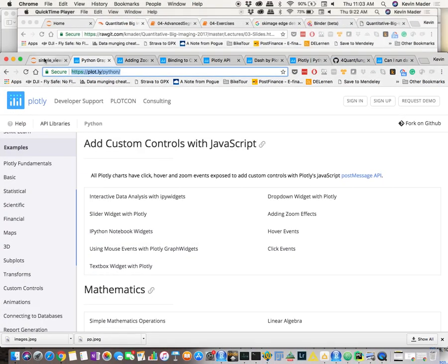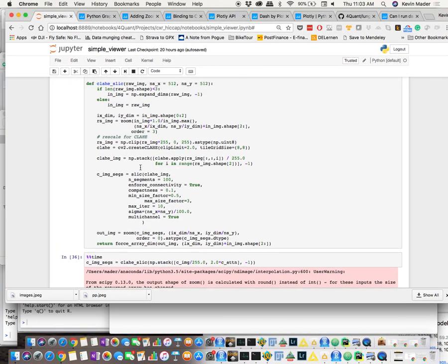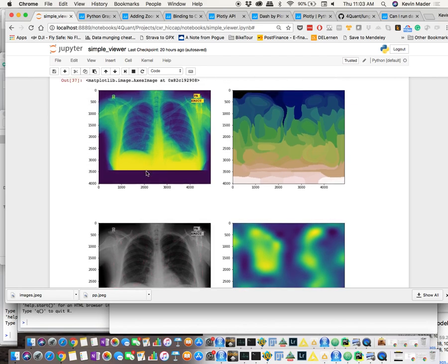But yeah, there's a whole number of tasks you can solve with superpixels. I think just yesterday, on another note, we were applying that to chest x-rays. So you end up with an image of a chest x-ray. And so this is very commonly used in screening. And you can use superpixels to group this into different regions.